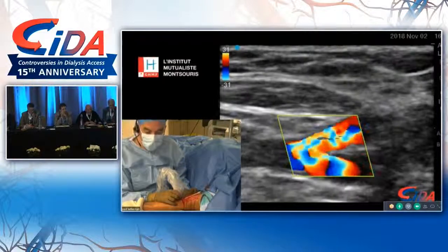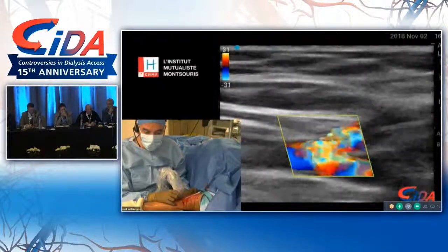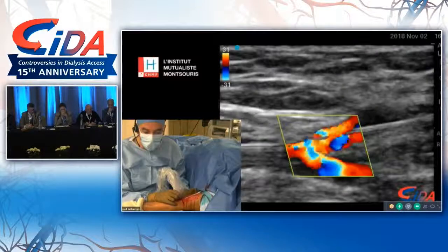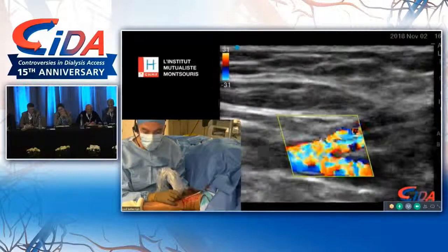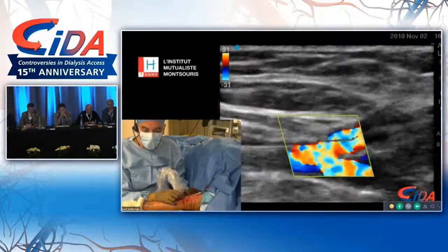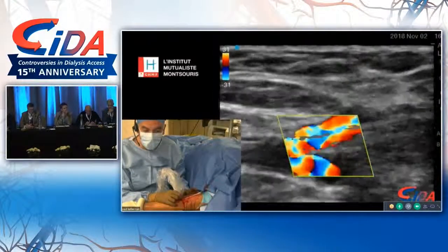contrary to most vascular surgery procedures, where calcified arteries are a big enemy, we didn't have a problem with calcified arteries here, because we have heat and pressure that applies on the artery, and this is applicable without any contraindication in calcified arteries. And actually, after we balloon them, they kind of stay open instead of having recoil.